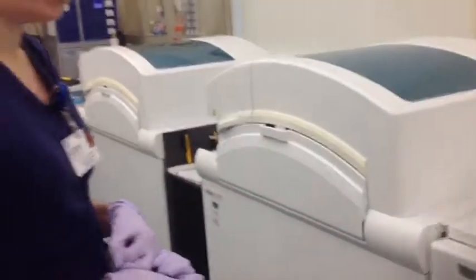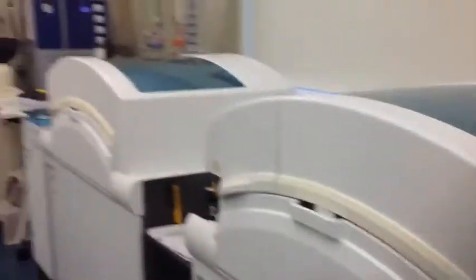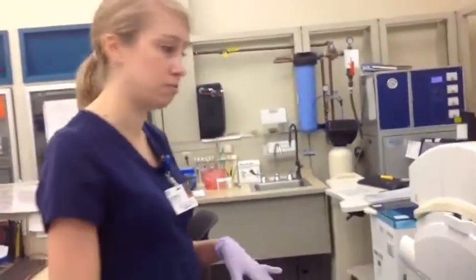This is our giant chemistry analyzer. We run about 100 different chemistry tests on this, including blood glucose. We also do sodium, potassium, chloride. We do cardiac markers to look to see if a patient had a heart attack. We also do amylase and lipase. So there's a nice variety of different types of chemistry tests that happen over here.